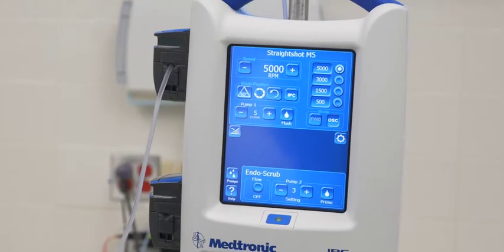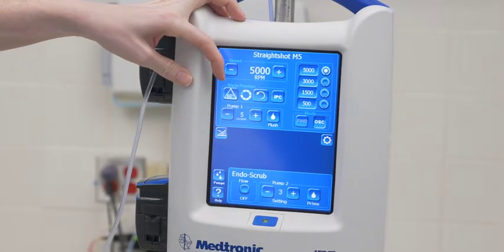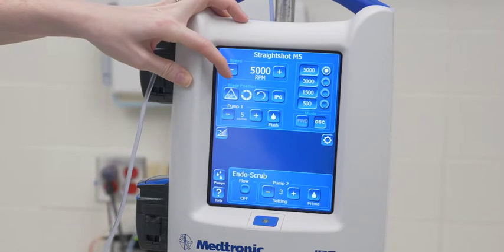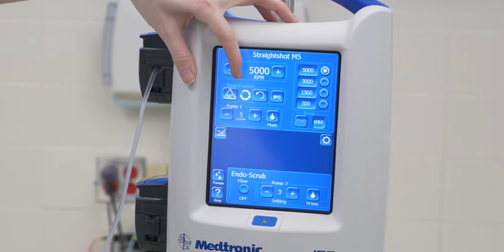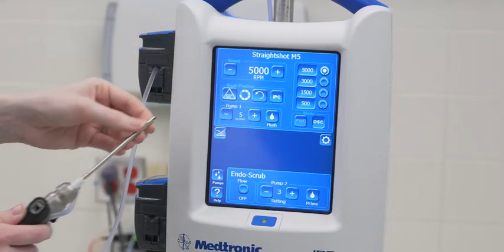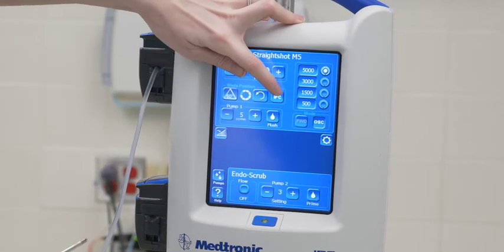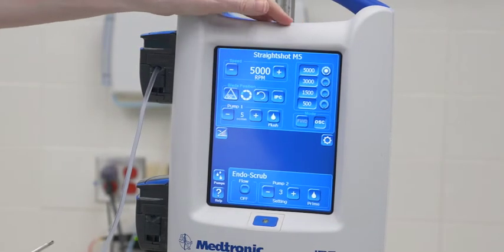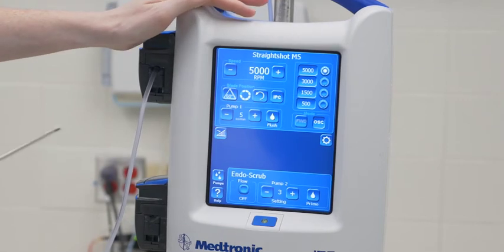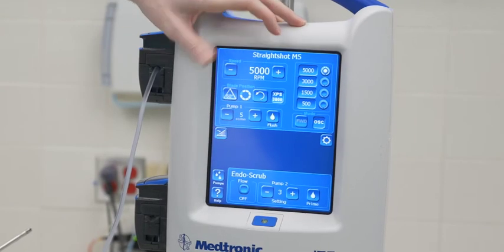So I just want to demonstrate what other buttons on this console do. 60 degrees has to do with where the microdebrider takes its bites. We always leave it on 60 degrees. I've never seen it changed. This next button here can be controlled on the foot pedal by the surgeons, and it also changes where the teeth get closed onto, I guess you could say. IPC switches back and forth between XPS 3000, and this is an old setting before this microdebrider became an M5. So sometimes older surgeons will want the older setting, which is the XPS.